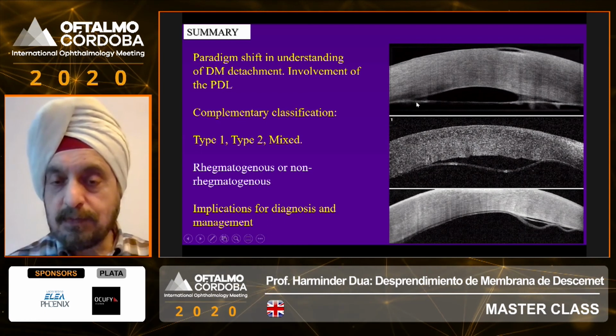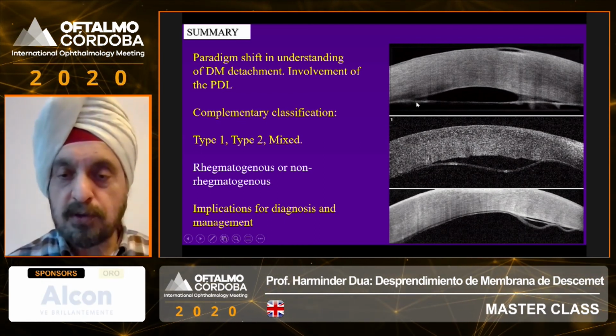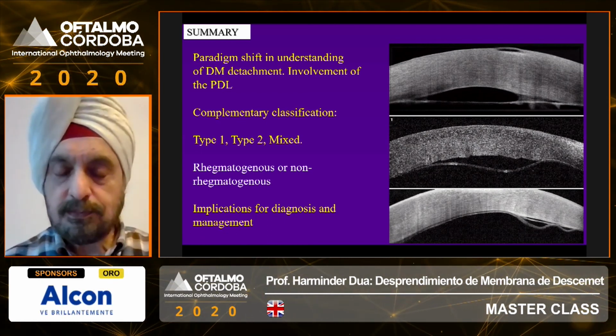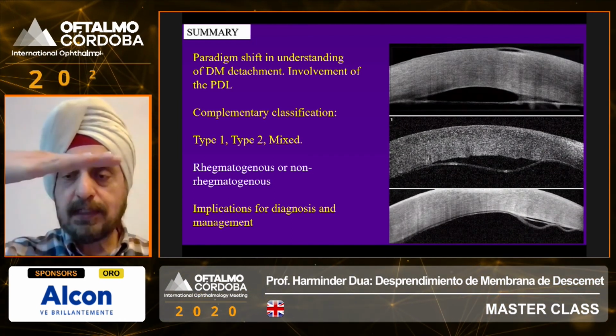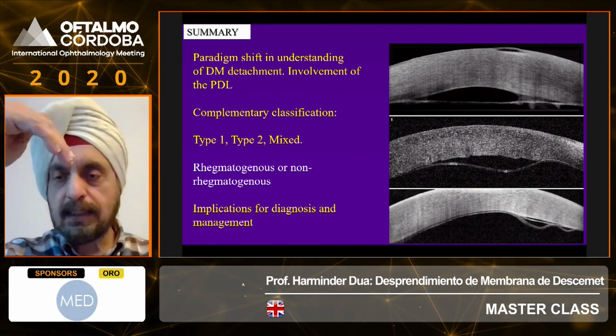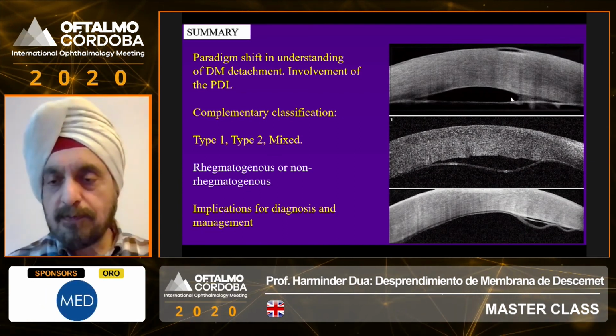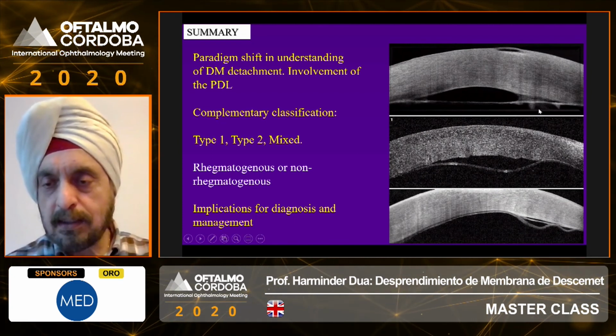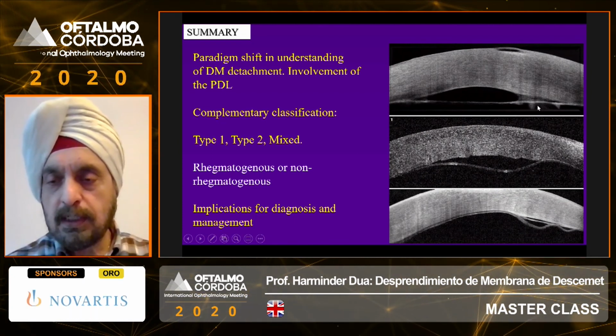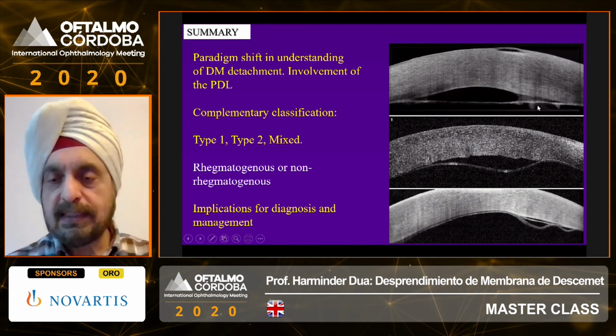If it is late, so if the cataract operation or the spontaneous occurrence was some weeks ago, it will not, because it becomes very tight and it will not go back like a curve. So we may have to do a descemetotomy, just to cut in an arc around the back of the cornea with a sharp needle and then put it back.